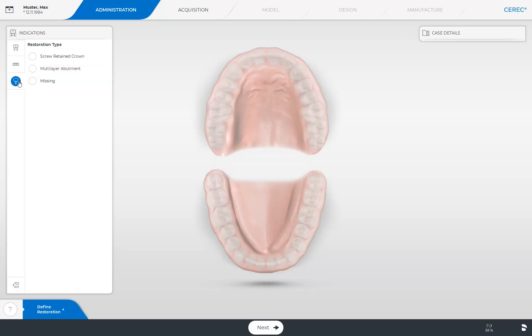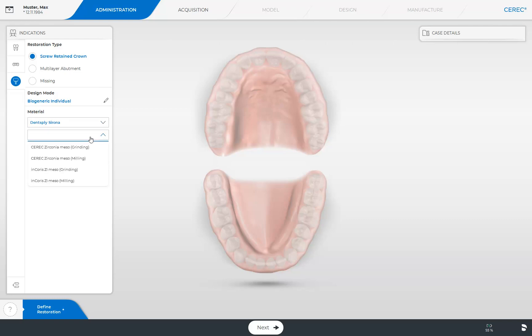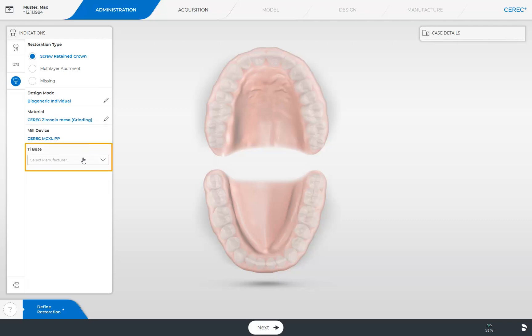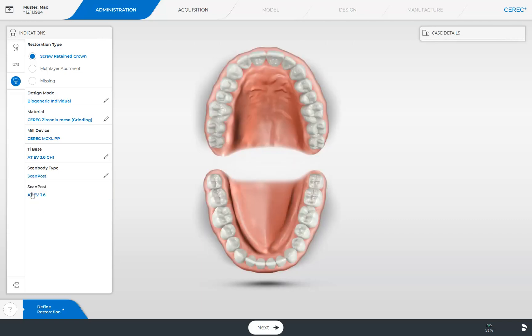This option won't be available if you select screw-retained crown. However, we will select the screw-retained option, determine the design mode, the material, the module, then the implant manufacturer, as well as the implant type, and with it the matching tie base. Finally, we will determine the scan body type. We select the scan post option since our implant is placed subgingivally and the tie base option could potentially be too short for a clear scan of the implant position. As soon as the odontogram is displayed, we determine our implant position.